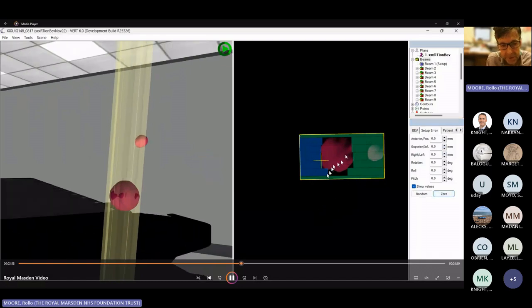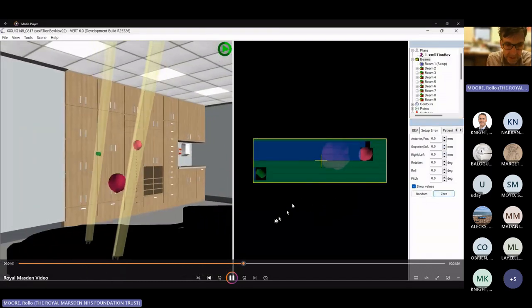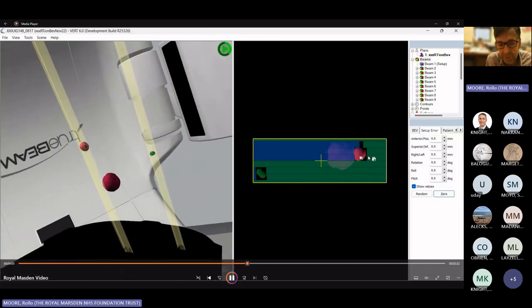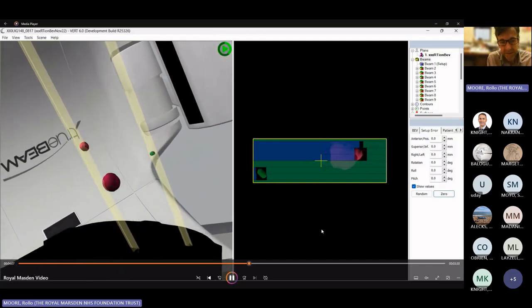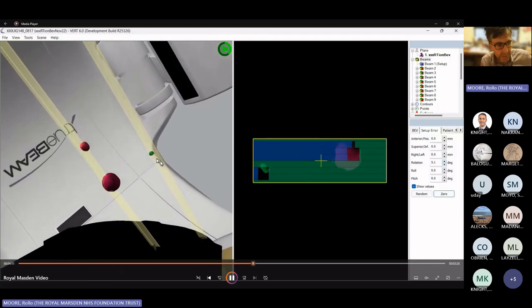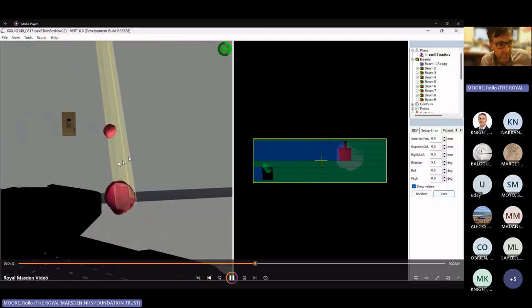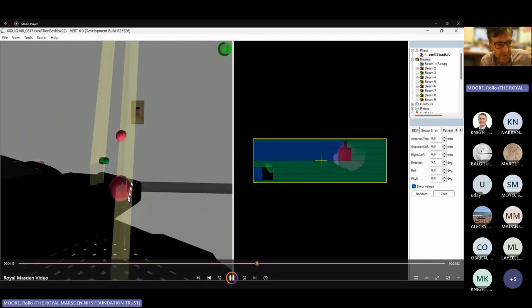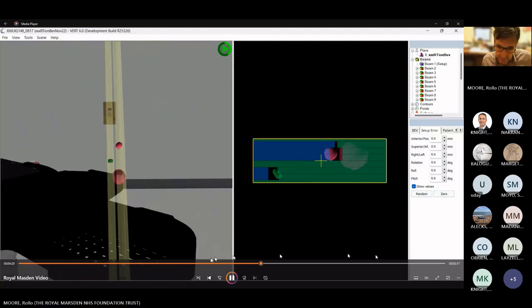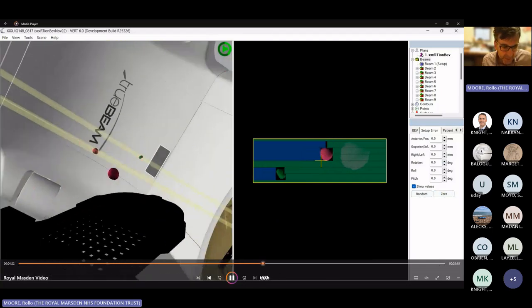And the aperture that we're aiming the radiation through is the open blackish aperture between the green and the blue leaves. So as the machine rotates around, you can see the corresponding beams on the left-hand side overlapping with the lesion or not. I'll pause that now, stop sharing that and go back to the main chat.